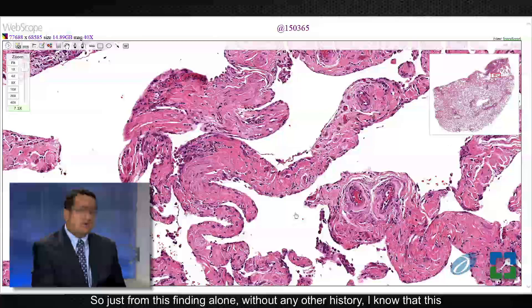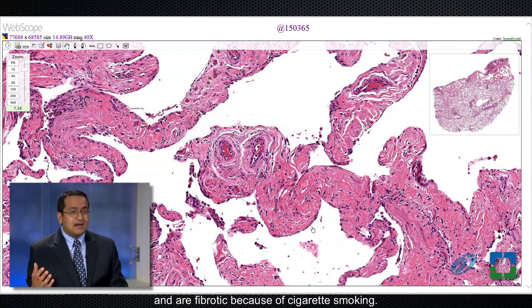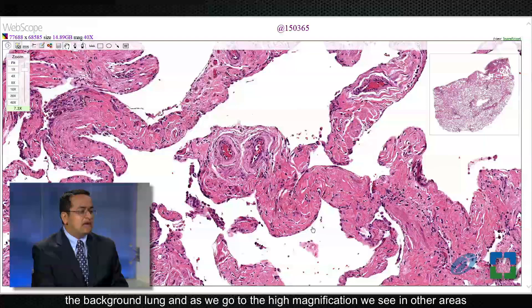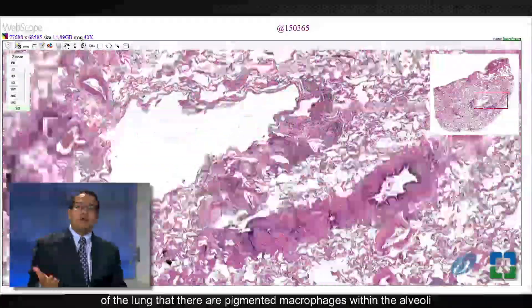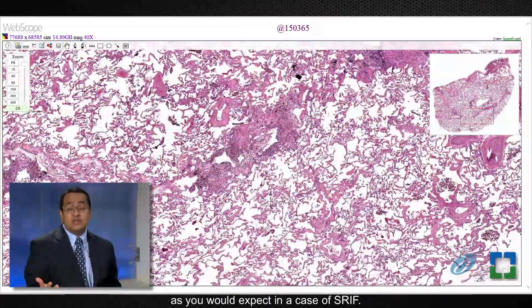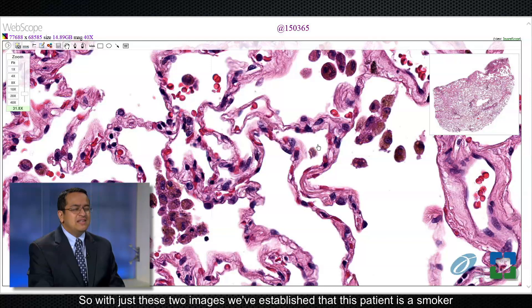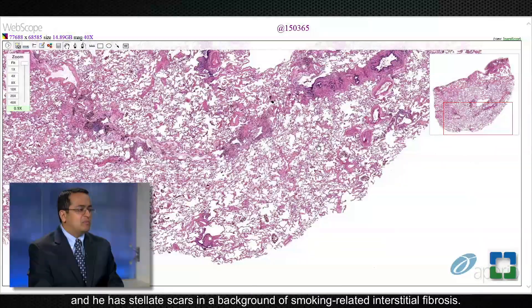Just from this finding alone, without any other history, I know that this patient is a cigarette smoker, and that his lungs are both emphysematous and fibrotic because of the cigarette smoking. We've already established that this patient has smoking-related changes in the background lung. At higher magnification we see in other areas of the lung there are pigmented macrophages within the alveoli, as you would expect in a case of SRIF — this finding is known as respiratory bronchiolitis. With just these two images we've established that this patient is a smoker with stellate scars in a background of smoking-related interstitial fibrosis.